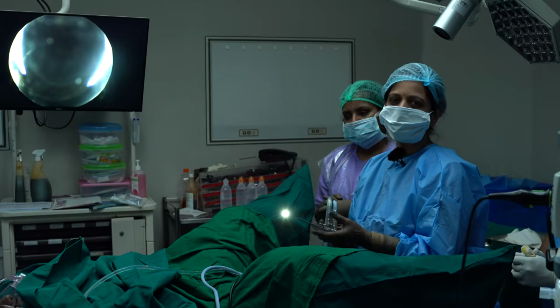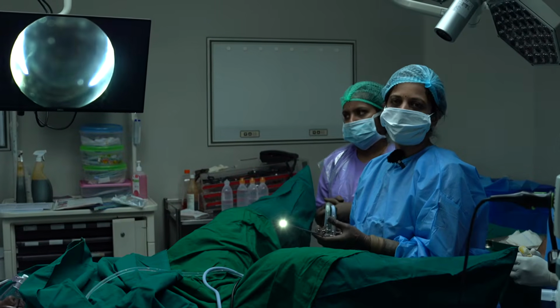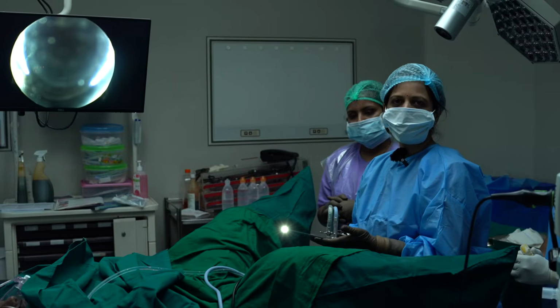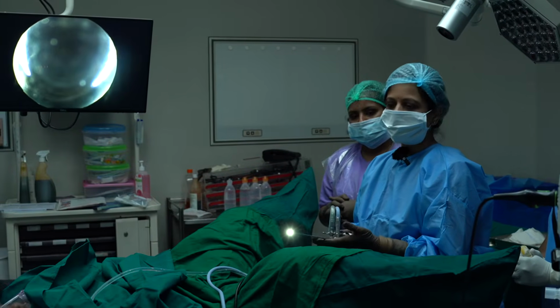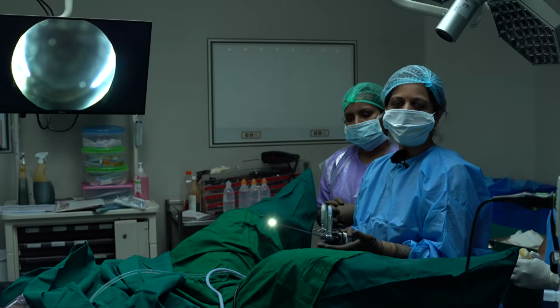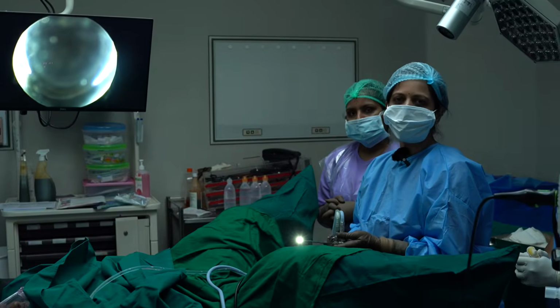Usually we do this procedure under anesthesia, and the patient's stay in the hospital is about 4 hours. This is a very safe procedure. It doesn't require much instrumentation. There is no cut and no suture when we do this procedure. This will take roughly 10 to 15 minutes to get over.